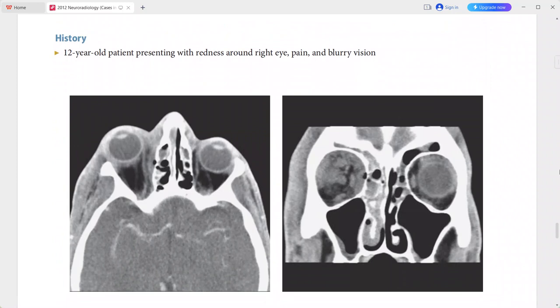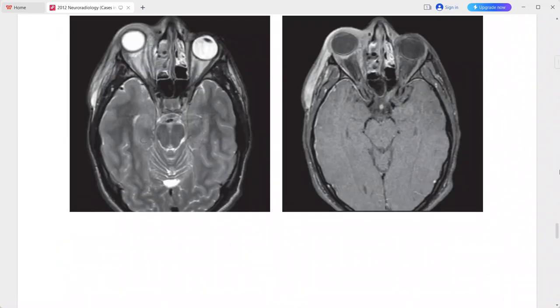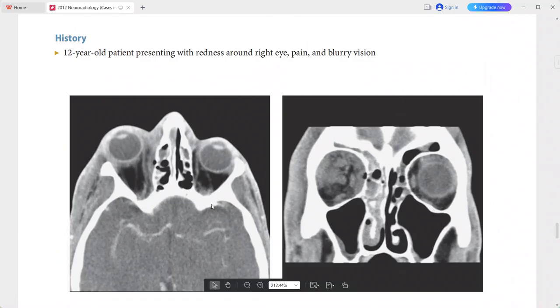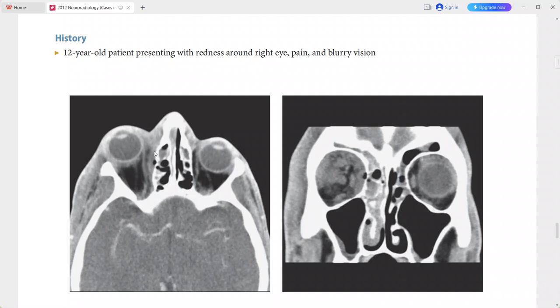Next is a 12-year-old patient presenting with redness around the right eye, pain, and blurred vision. On CT scan, there is a small rim-enhancing collection containing a small bubble of gas in the extraconal space, medial to the medial rectus muscle and adjacent to the lamina papyracea.